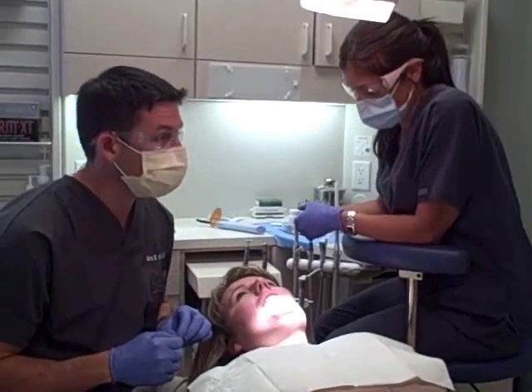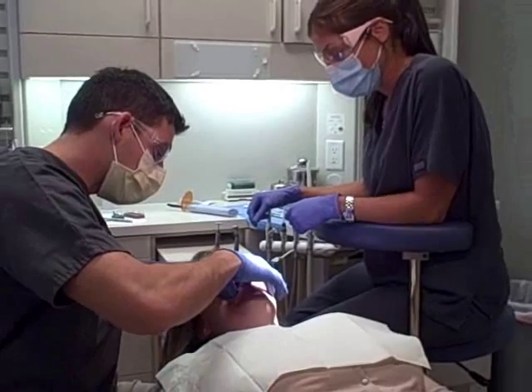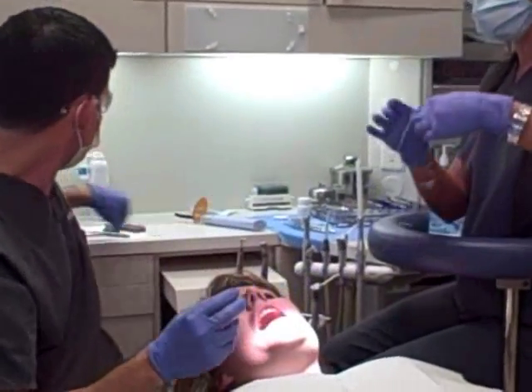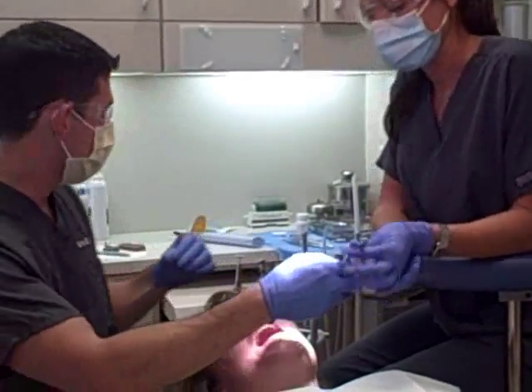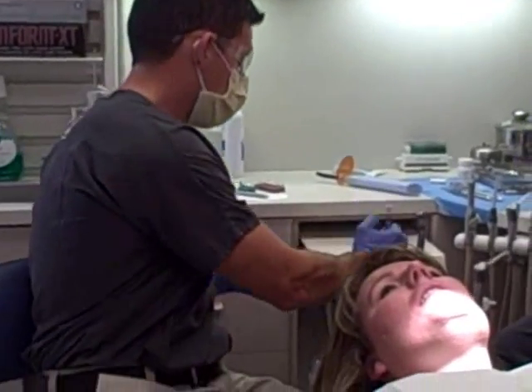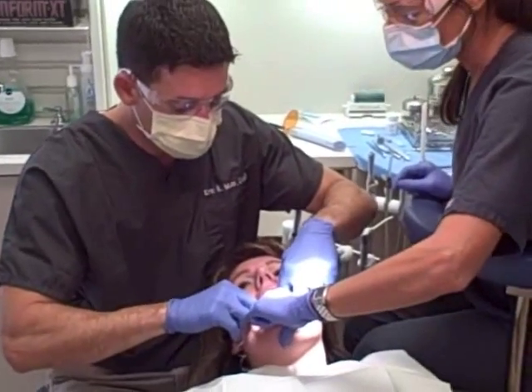So here we are back with our patient. We're about 30 minutes into the procedure. We have our puzzle piece ready to go. We're actually going to try it back into the mouth and into the tooth, and then be able to adjust outside the mouth. We're going to try our enlay in and then check our contacts. It's a little snug. The beauty of this restoration is I'm able to take this puzzle piece from outside the mouth and actually adjust our contact to get the fit just right. Our whole goal is to reduce bacteria collection. I'm actually using a polishing instrument to create a smooth glass finish on the porcelain piece, and then we'll come back into the patient's mouth to try the piece in place and get the perfect little finish.